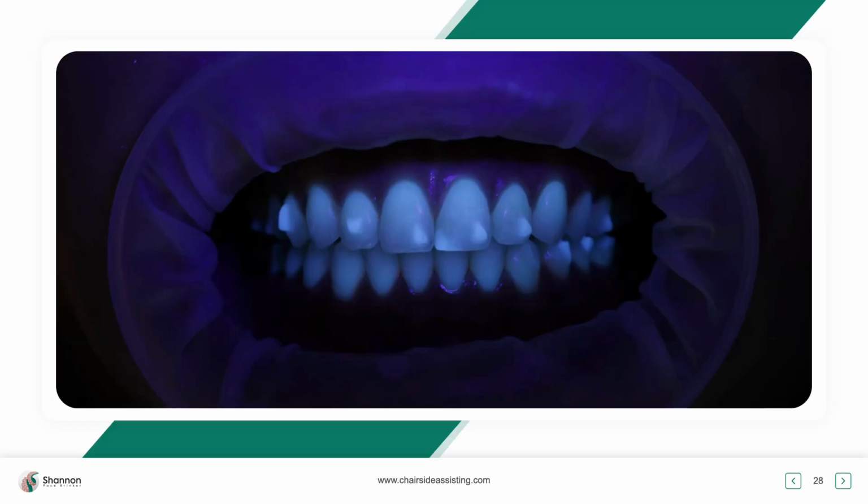Now let's get into taking these off. Part of your hands-on is not going to be removing the attachments. That's a totally separate learn because there's a lot more to it than just removing it with a burr. But I want to share with you, this is the beauty of Tetric Evo. My daughter fell when she was younger, and we utilized Tetric to replace her class 2. As you can see here, it is lit up.